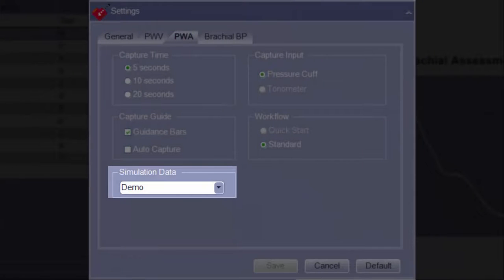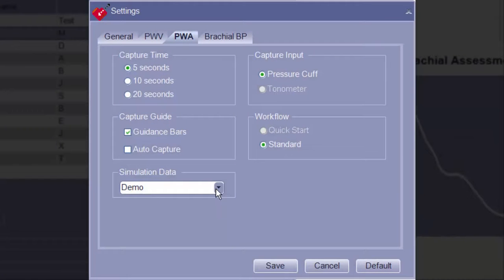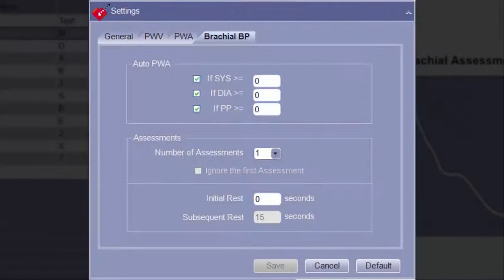In the Simulated Data section, the default file used during simulated assessments can be selected. Additionally, when an error is encountered during pulse wave analysis assessments that prevents a report from being generated, a simulated file is automatically created and placed in the simulation directory. This file can then be selected from the drop-down menu and used as a source of troubleshooting. At this time, in both the Capture Input and the Workflow section, there is only one option that can be selected and it is not possible to change.